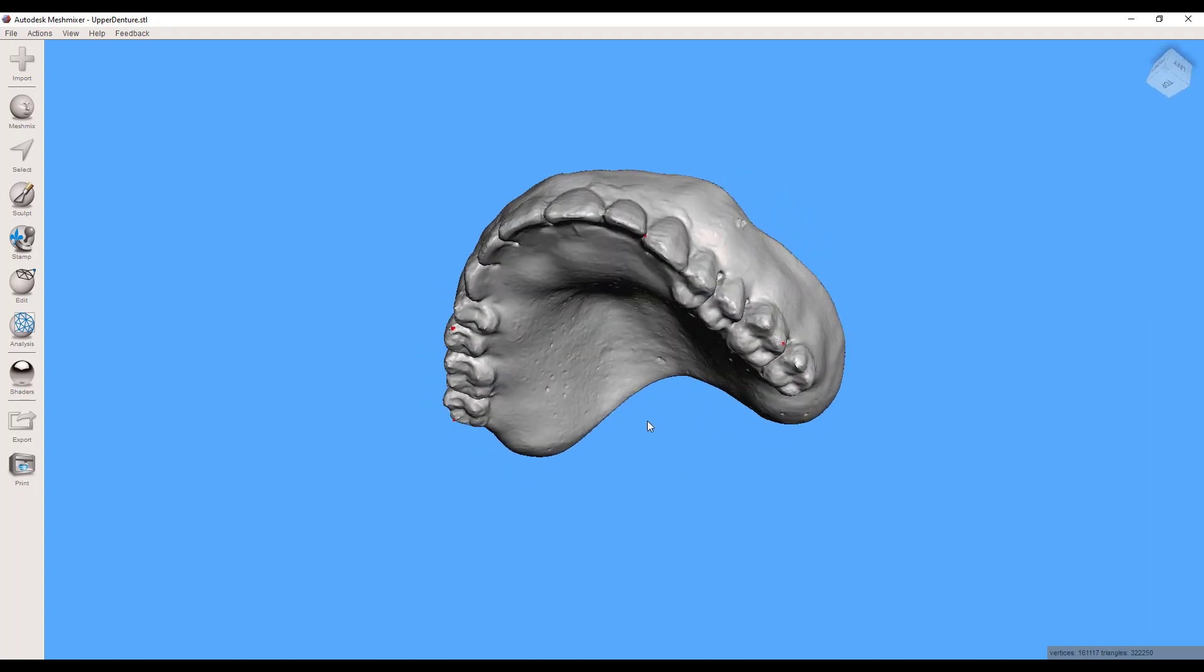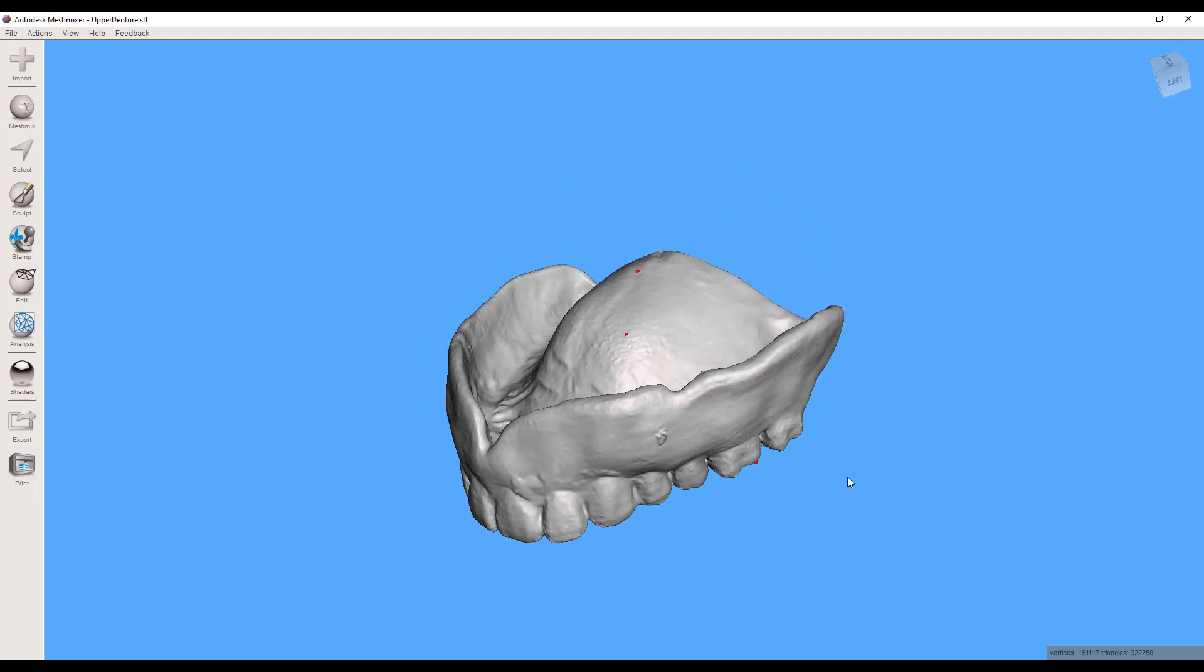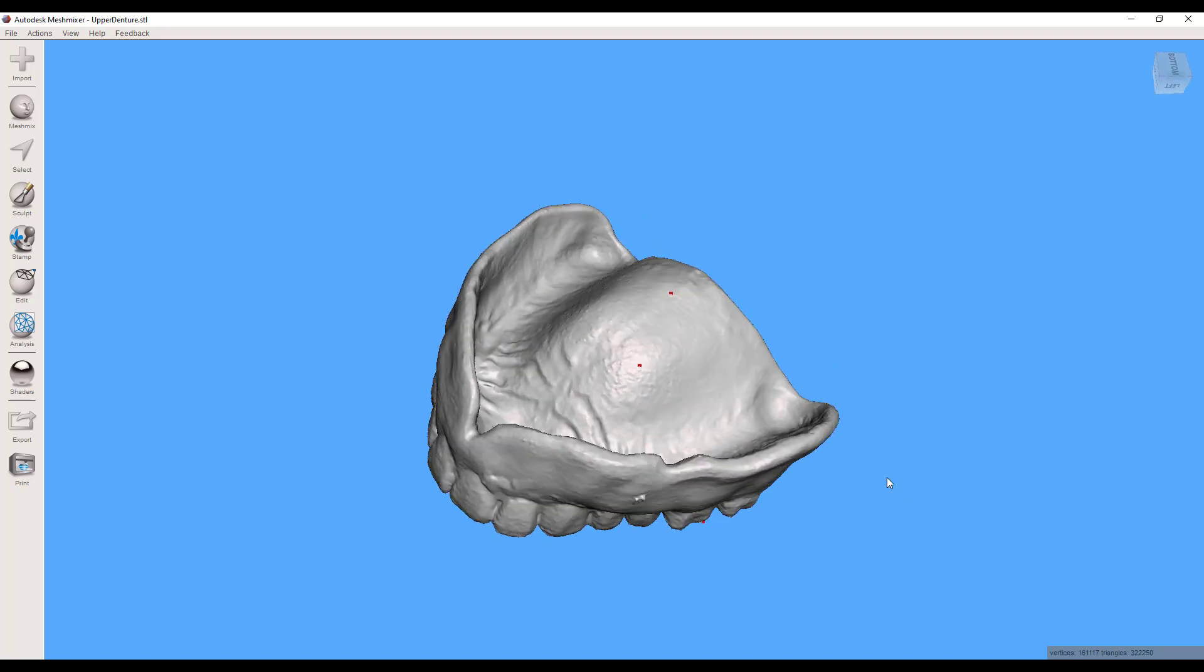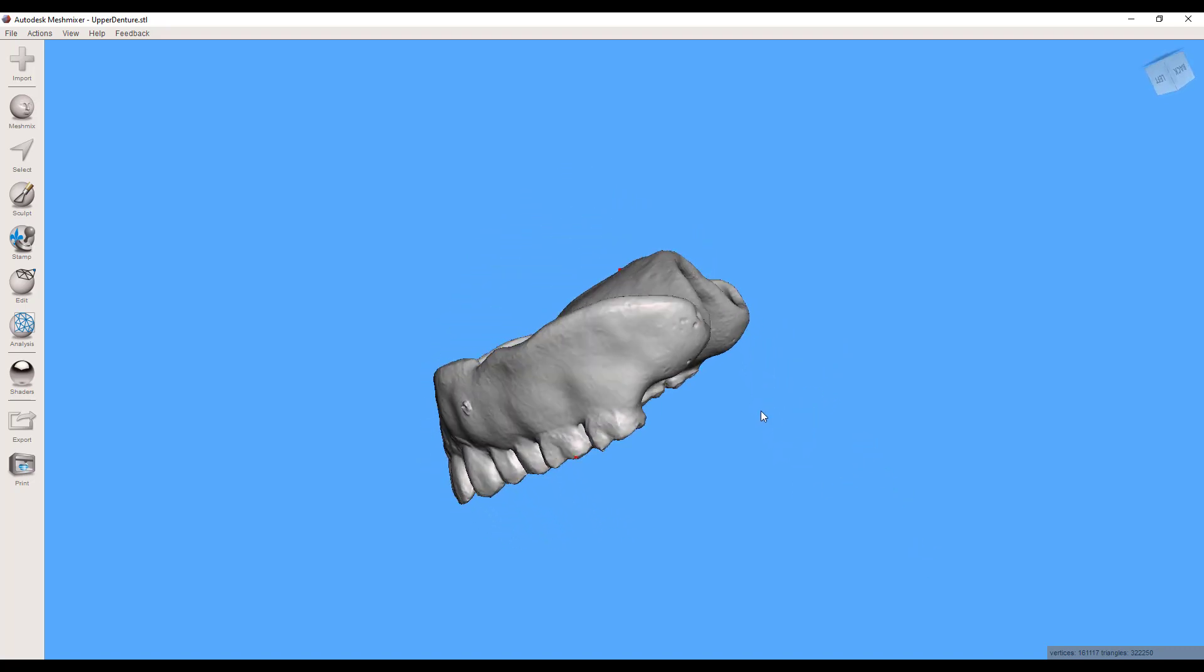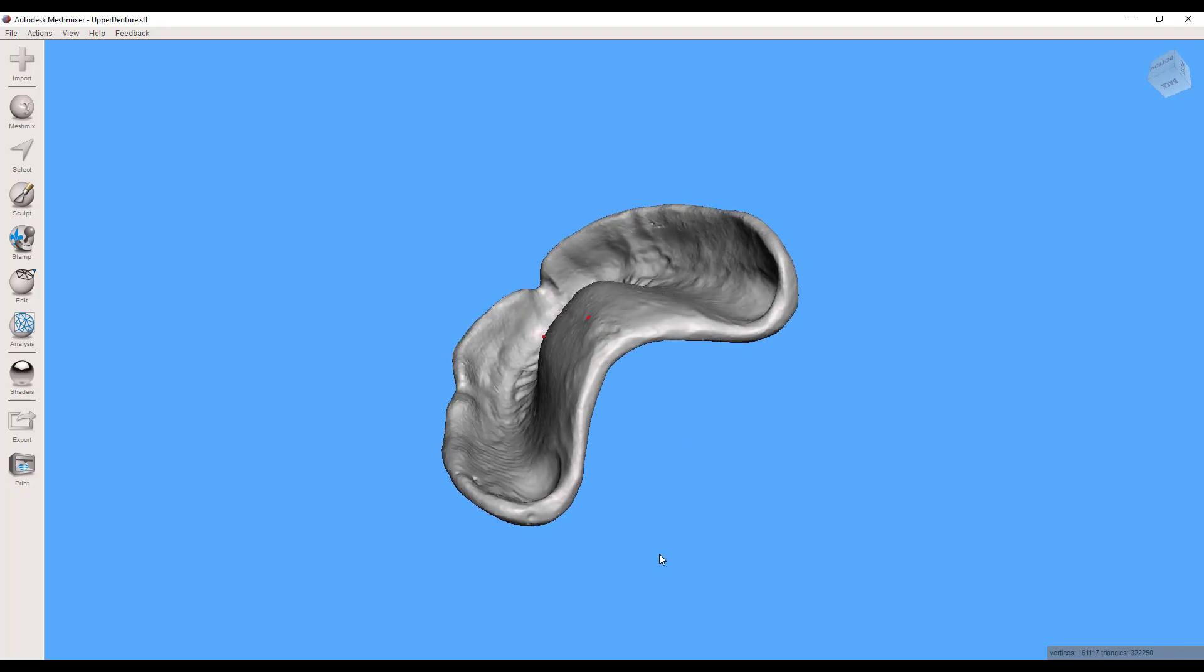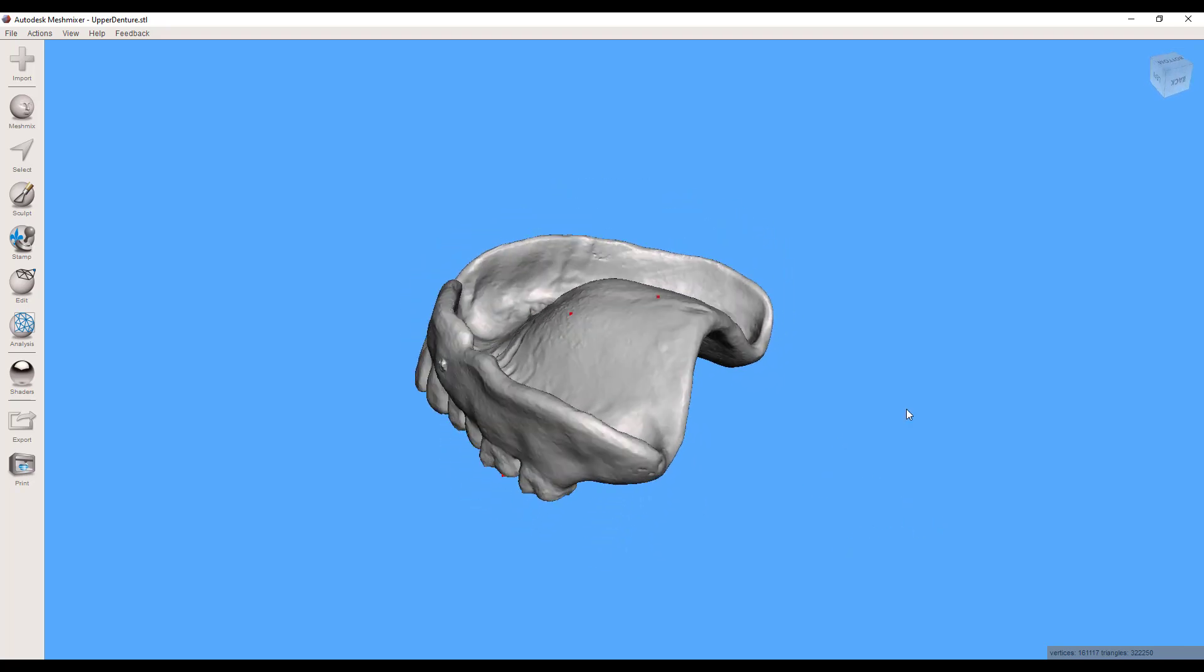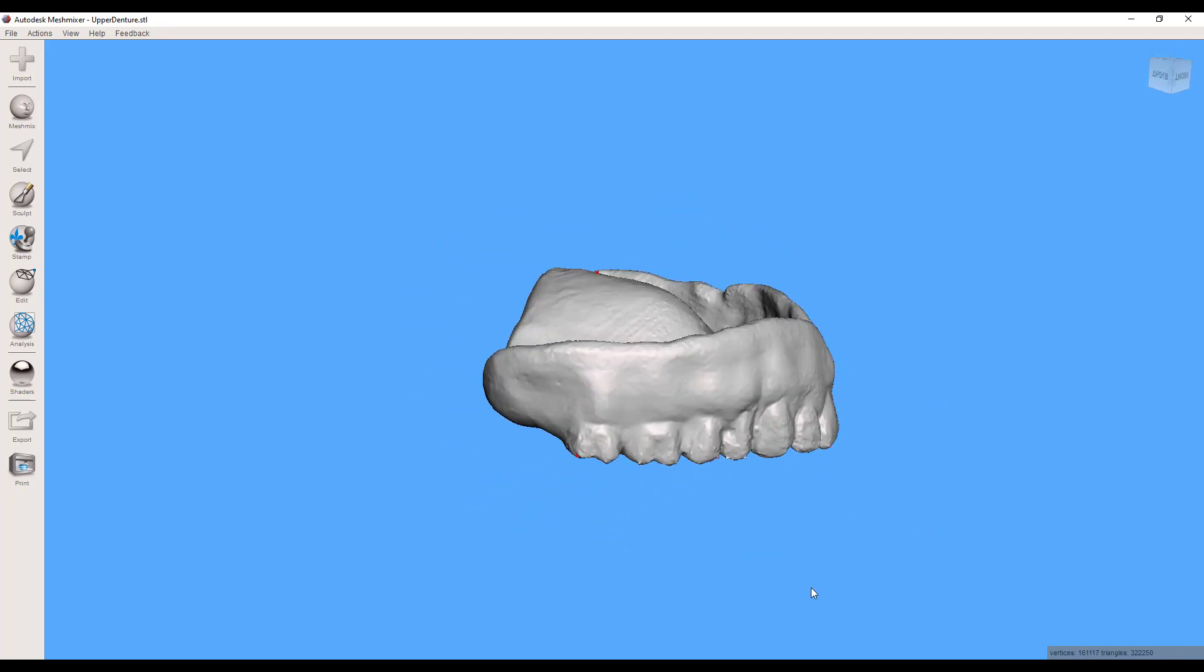And this can be a really helpful thing to have. You know, patients want to always have a backup denture. So you could actually scan their dentures and then just tuck this STL away if they ever need it because they've lost their denture for some reason. You'll be able to make them one.